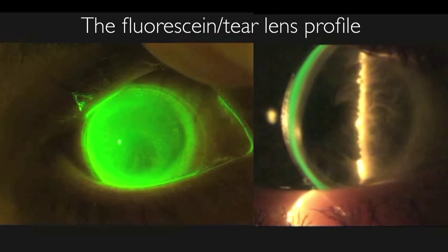So that's how I go about choosing where to start and what sagittal height of lens to use. I look at the eye — the cornea and the sclera — evaluating the corneal depth and the scleral shape.